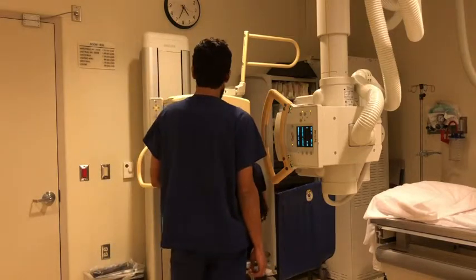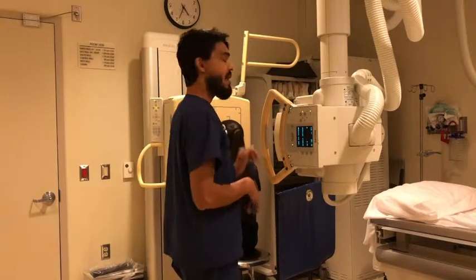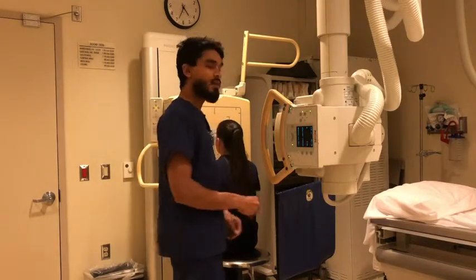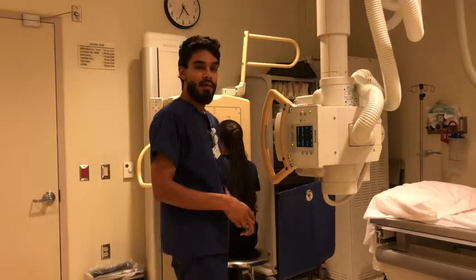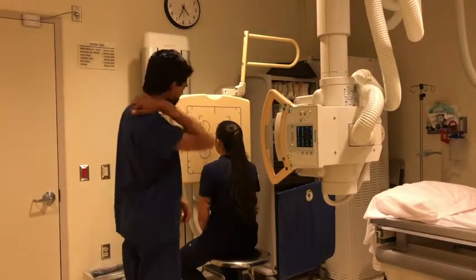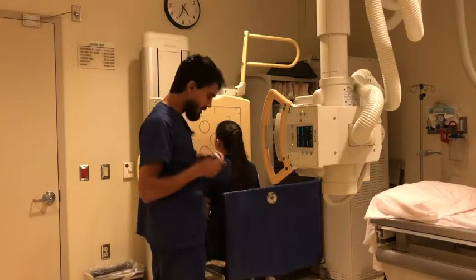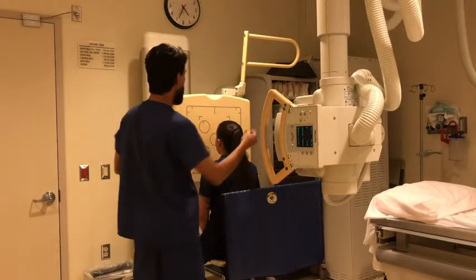Okay. And I have my console pre-set up to 85 kV and 71 mAs for this Caldwell view. It's a PA Caldwell view. So for this view, I'm going to make sure that our shield is in place first, and then I have a marker on the board.